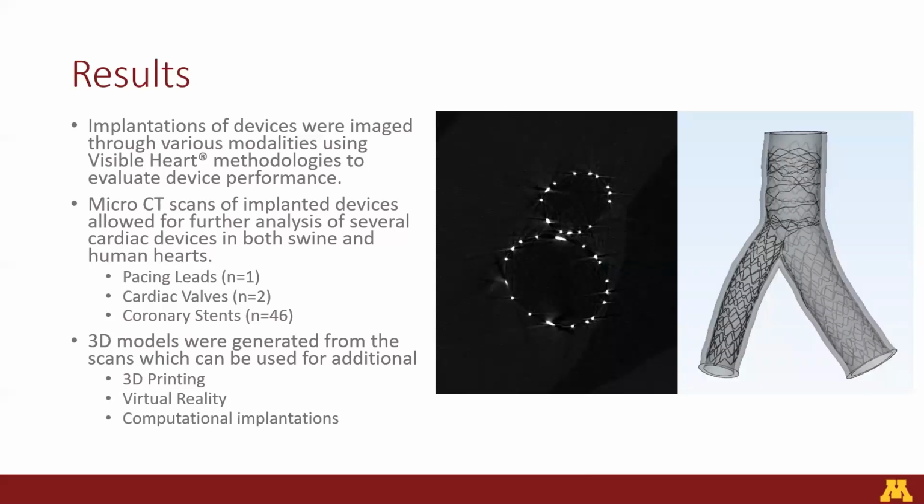In addition to all these analyses and measurements that can be made, 3D models can also be generated from these scans, which can be further used for 3D printing, virtual reality, and performing computational implantations. All these combined can prove to be beneficial to physicians to gain a better insight on the devices they are implanting on a day-to-day basis and aiding medical device designers in designing the next generation of these devices.